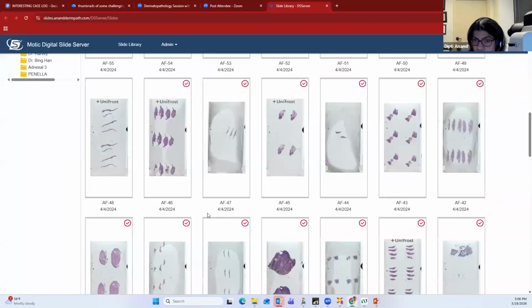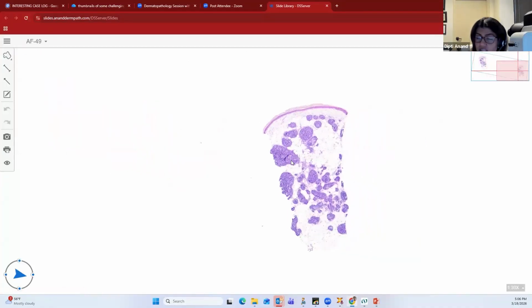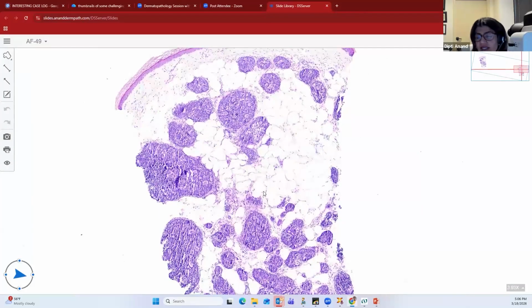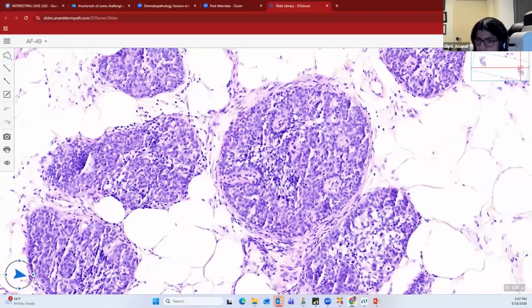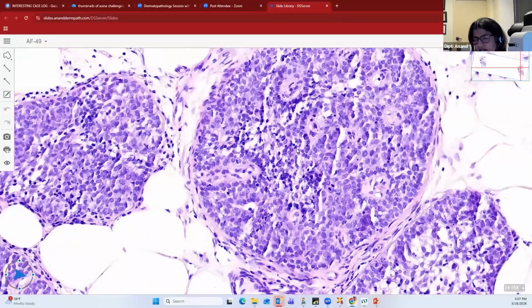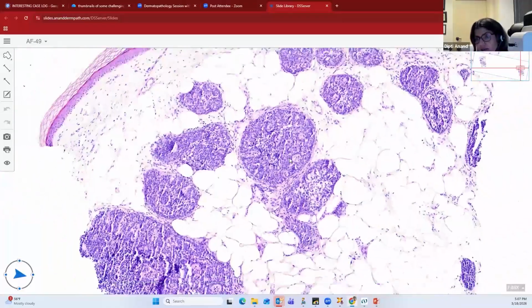The next entity, which is rare among follicular tumors, but I'm going to talk about it because they can ask you, is a cutaneous lymphadenoma or an adamantinoid trichoblastoma. Both are in a similar spectrum. They are variants of a trichoblastoma. So the background tumor looks like the trichoblastic islands, the immature follicular epithelial islands without the stroma, but then there are lymphocytes which are attacking these follicular islands. So this looks like a swarm of bees, lymphocytes which are present amidst these follicular epithelial islands.